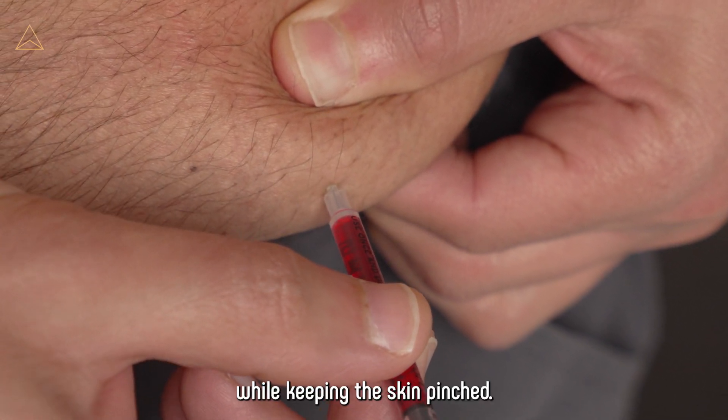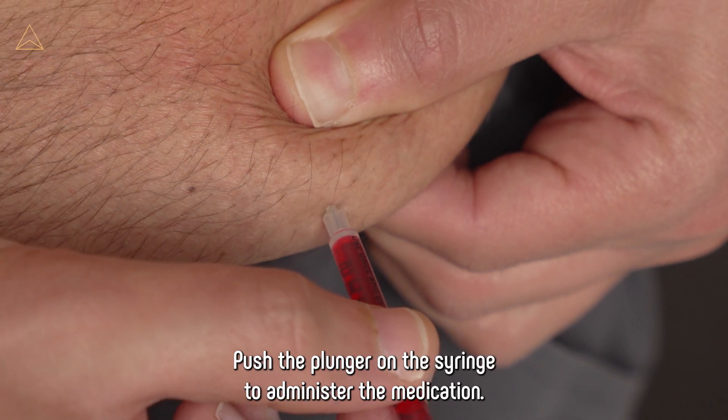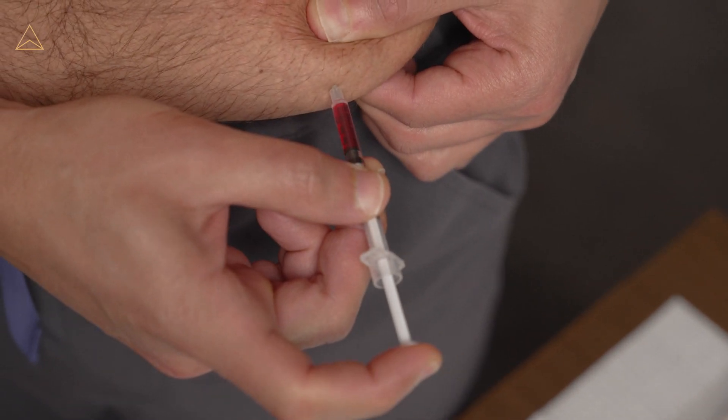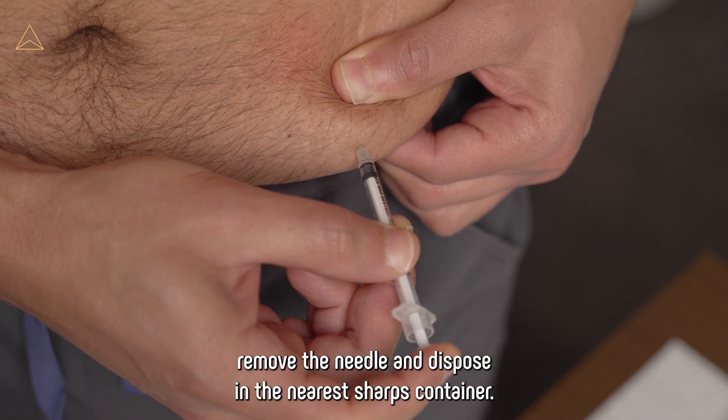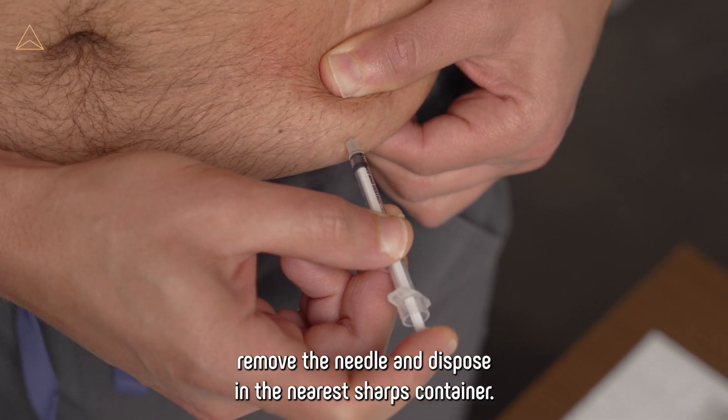While keeping the skin pinched, push the plunger on the syringe to administer the medication. Once all medication is pushed into the subcutaneous tissue, remove the needle and dispose in the nearest sharps container.